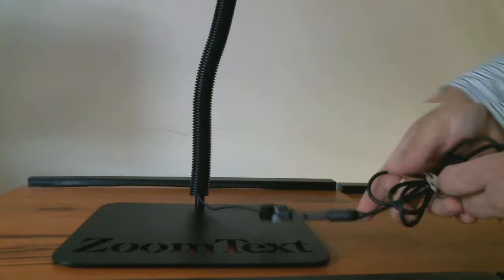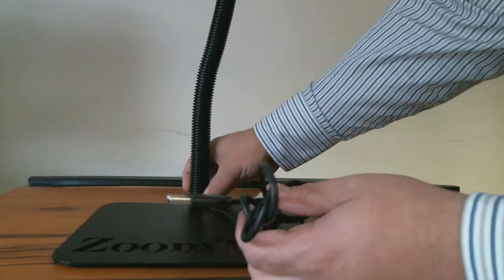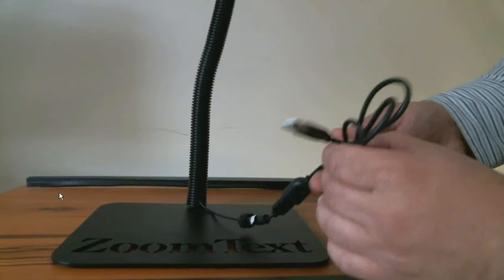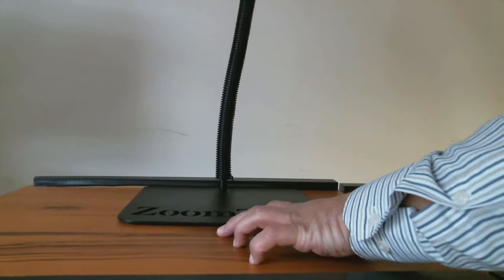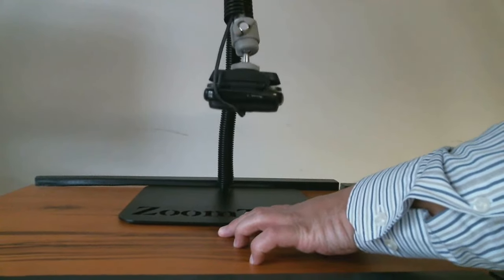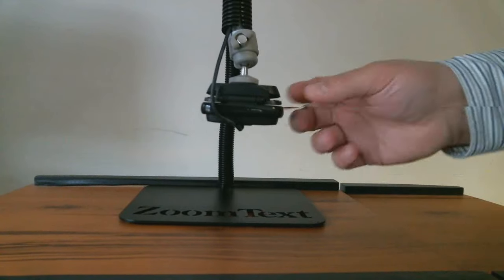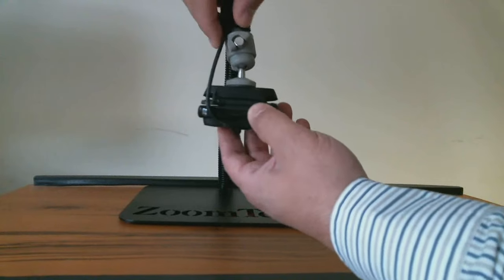Okay, so that's just going to snap right in there. You'll have your USB cord at the end of that, which you then plug into your computer. Let me move this back a little bit. Then what you would want to do is bend the arm until I can get the camera into view here. Now, the camera itself is kind of collapsed in here.